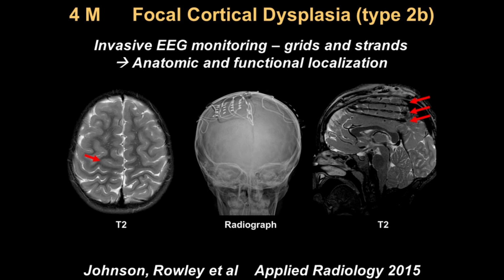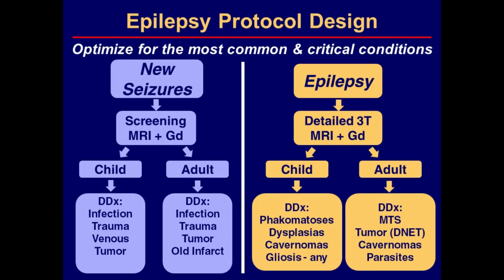We could then localize exactly where these were located at the time we were recording ictal events during a video EEG hospitalization. And then having co-localized this abnormality structurally to the electrical activities recorded during seizures, the surgeons and the epileptologists and the family and we were all more confident that this should come out, which it did, and was a proven cortical dysplasia, and this child has remained seizure-free. So those are some things we think about in pediatric populations.